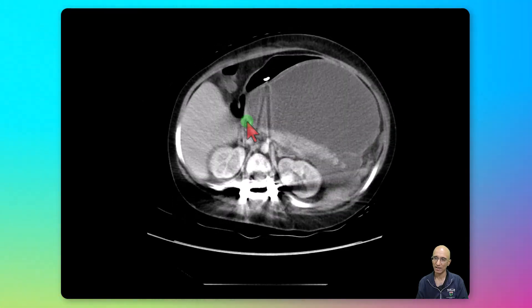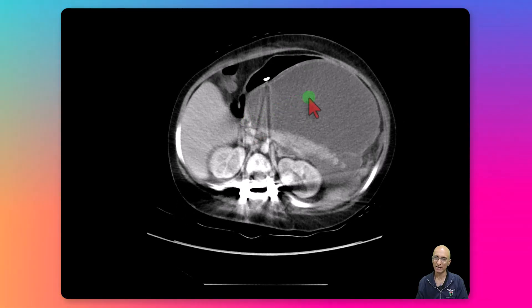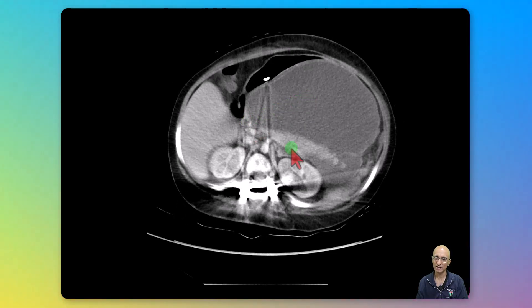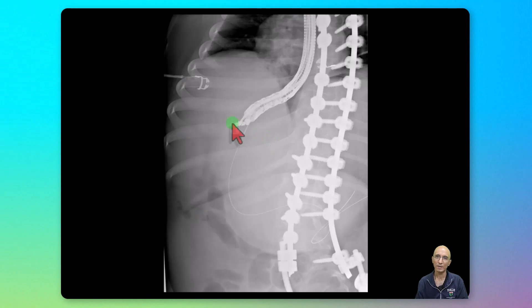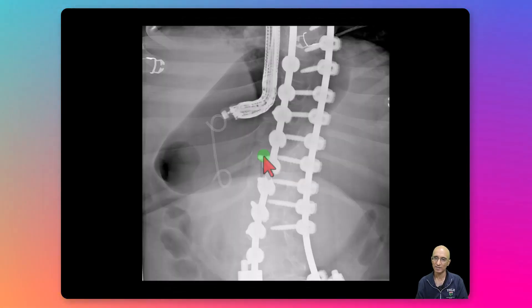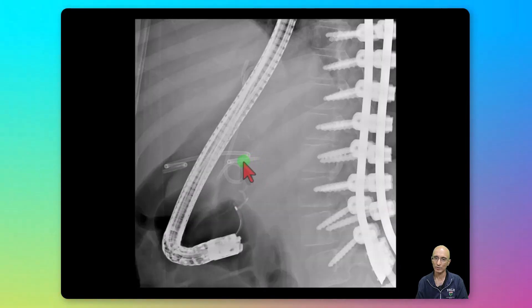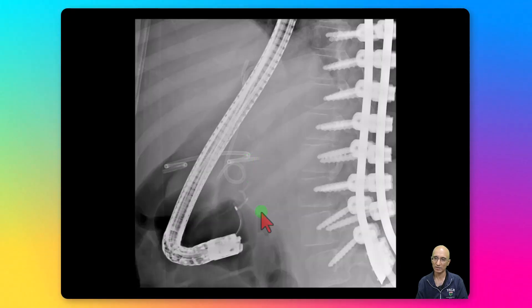Appearances are highly concerning for pancreatic pseudocyst in the setting of recent scoliosis surgery. The patient underwent ERCP examination. A CBD stent was placed, and a cystogastrostomy tube was also placed during ERCP.